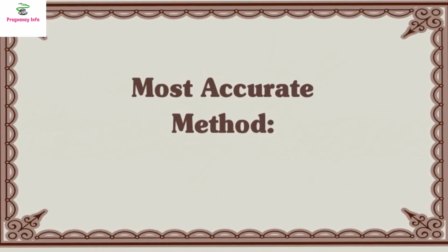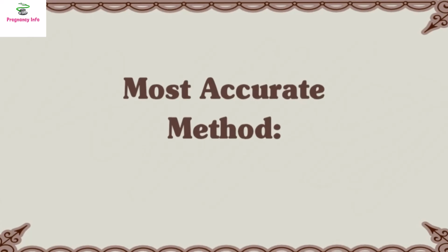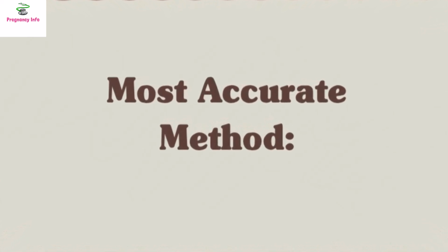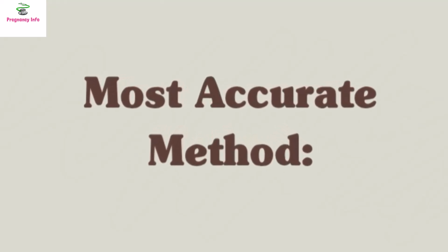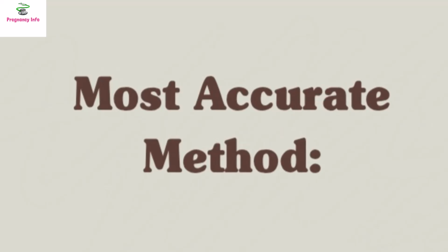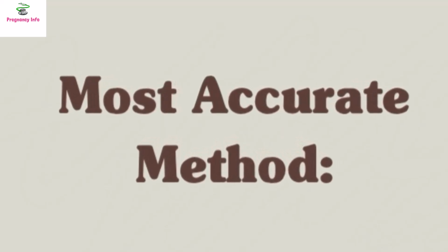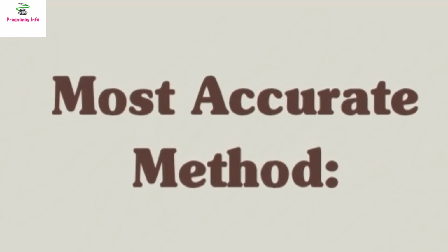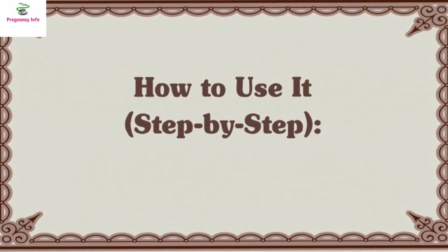Now, which one is the most accurate method? First Response Early Result. This test is considered the gold standard because it detects extremely low levels of the pregnancy hormone hCG, down to just 6.5 mIU/mL. It can identify pregnancy up to 6 days before your missed period, with more than 99% accuracy by the day your period is due. How to use it?